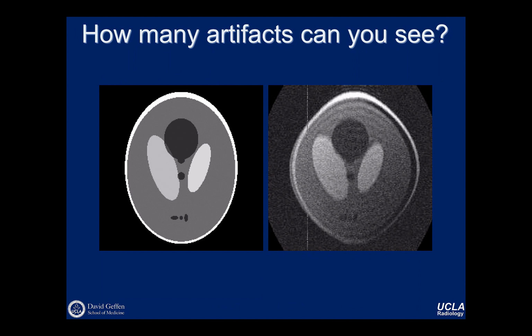You might load up the patient with a bunch of coils because you're not exactly sure if you're going to do abdominal imaging or if it's going to be a little more north, so you put on some more coils, fine. But you don't want to receive everything from all of those coils. It'll be a ton of data, and it won't necessarily improve your image quality having a coil that's distant from the underlying object. So you could have a faulty coil. The coil itself could be busted in some ways. That definitely happens. The other possibility is that it's just software control. The channel was turned off during the acquisition. There's at least one more.